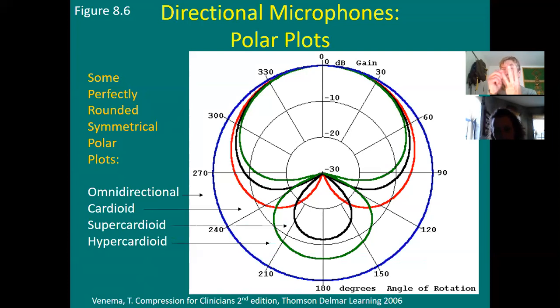each of those little decibels improves speech recognition by several percent. And you've got 3 times 5%, let's say, that's a 15% improvement. Not bad. Better than a poke in the eye with a sharp stick. Okay, so we've got to look at these things realistically.